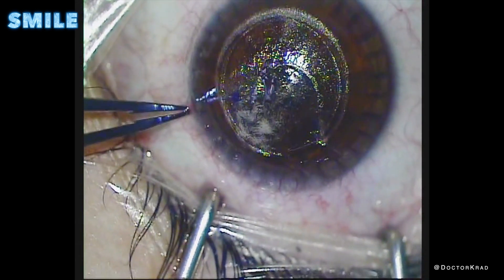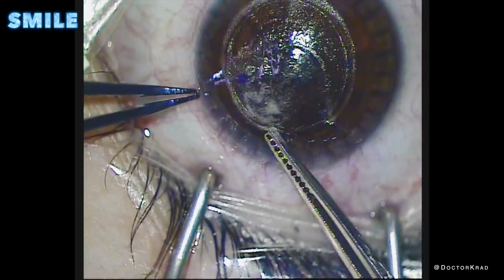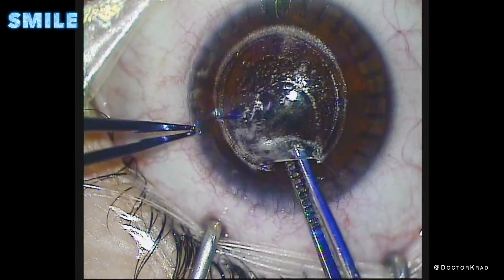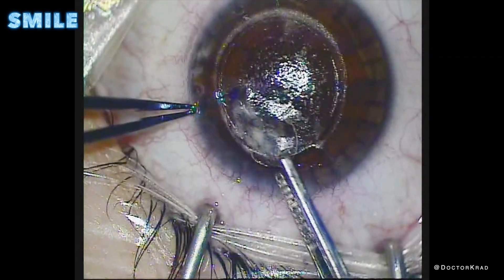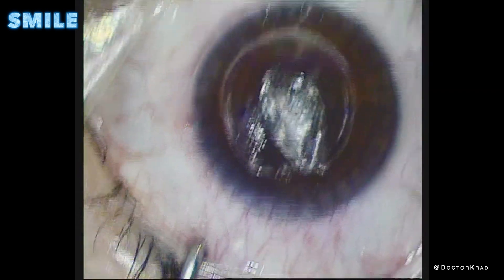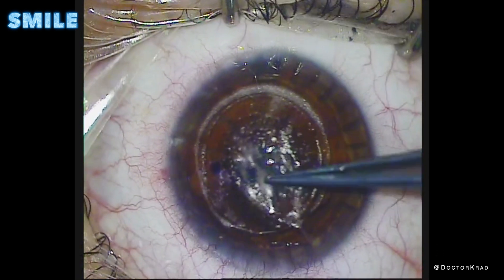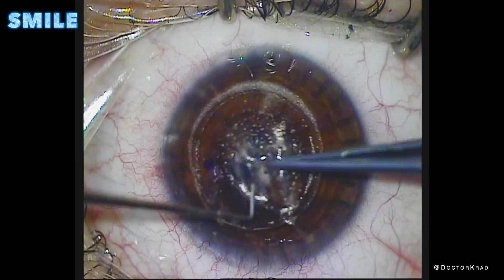Next, I will use some tissue forceps to remove the disc of corneal tissue. I want to grab a good amount of the disc of tissue so that I don't tear it. You want to avoid leaving behind any tags of tissue. And here it comes out pretty easily. Then I put the tissue on the front of the cornea because I want to make sure that it's a complete circle and that I didn't accidentally leave behind a segment of tissue. So we open that up and confirm that the disc of tissue is complete.